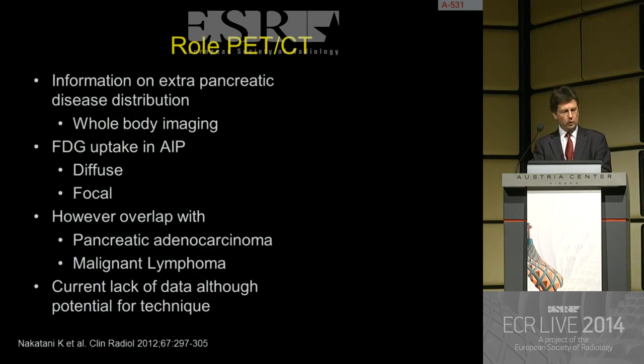I mentioned about the role of PET-CT. This will give us information both about the pancreas, but also, importantly, on extrapancreatic disease distribution.